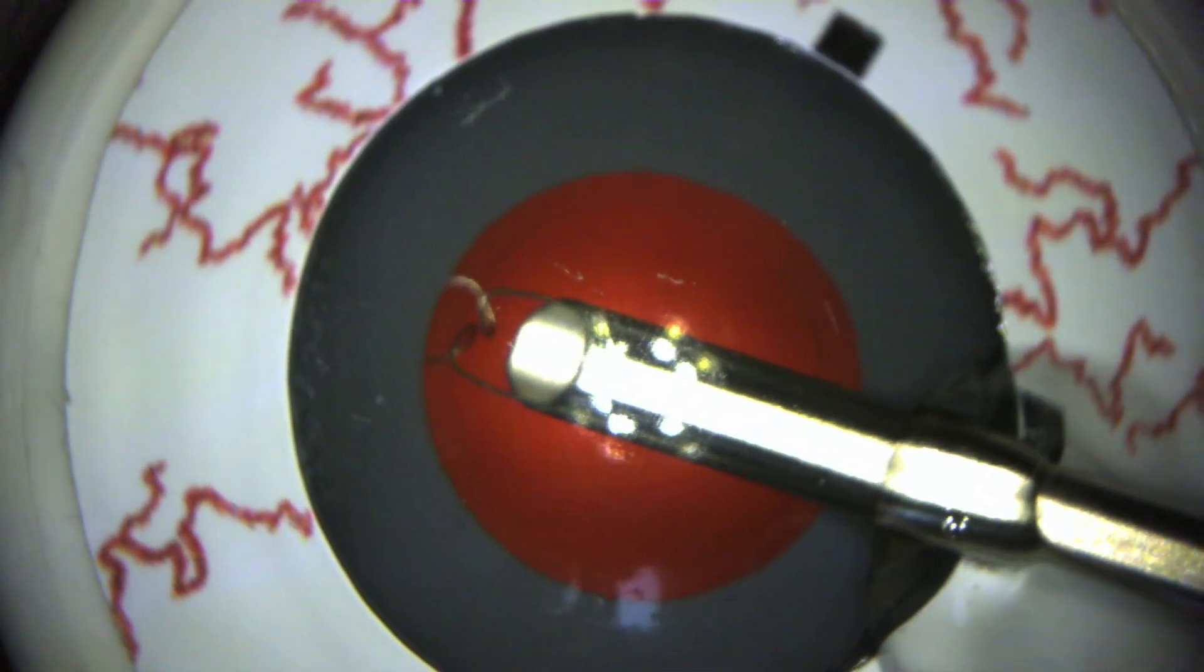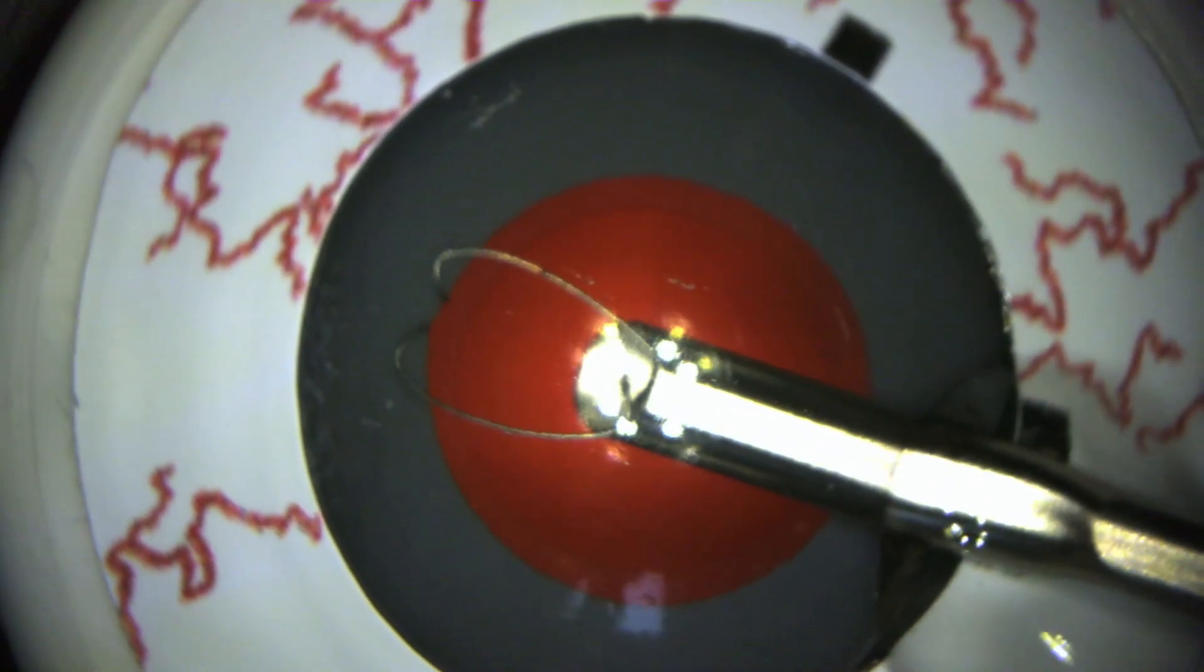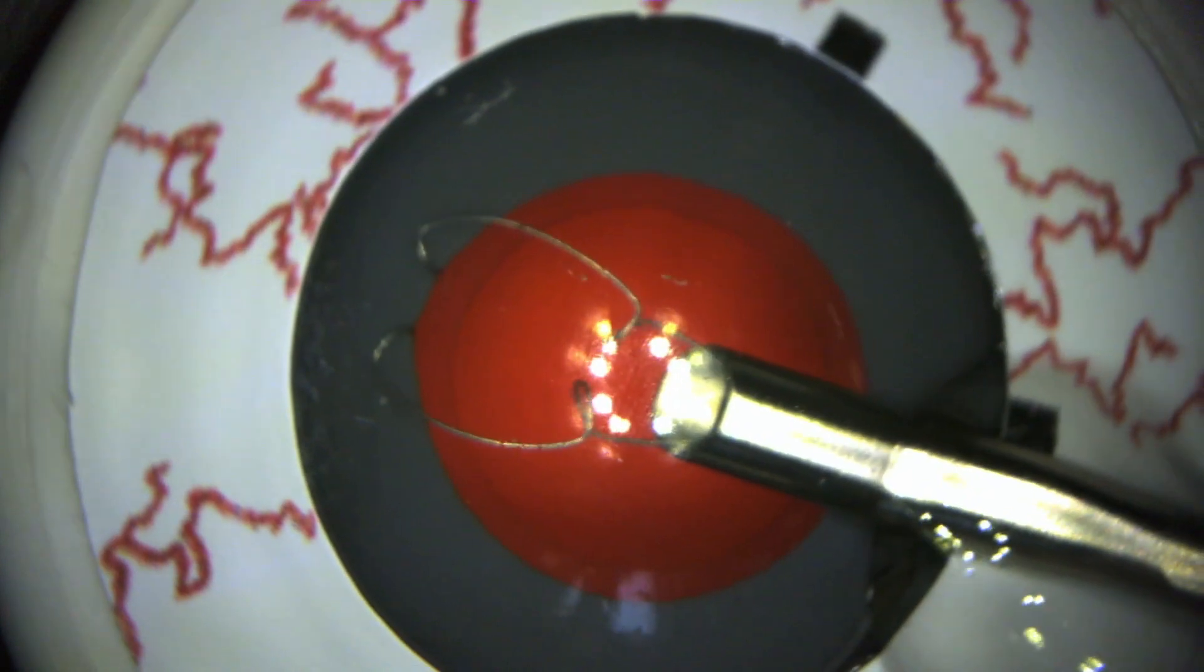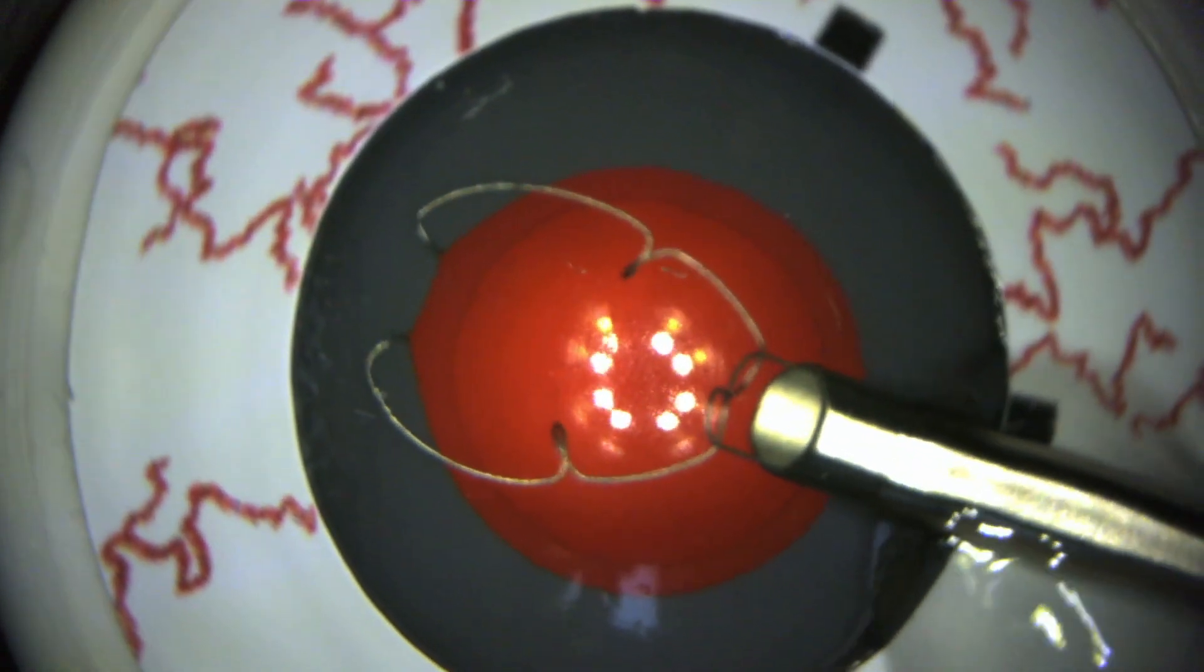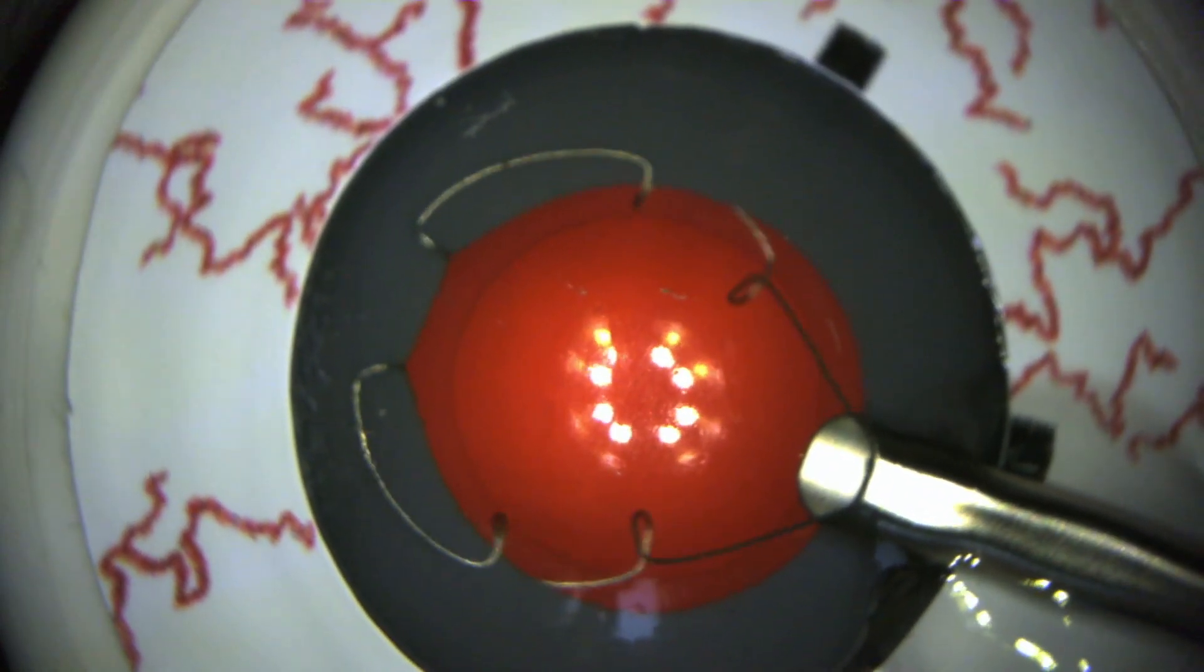As the device is deploying, be sure the lateral feet are fully separated before full advancement into the eye. I like to suggest staying right about here with the injector as you finish releasing the device to ensure each lateral foot is placed under the iris.